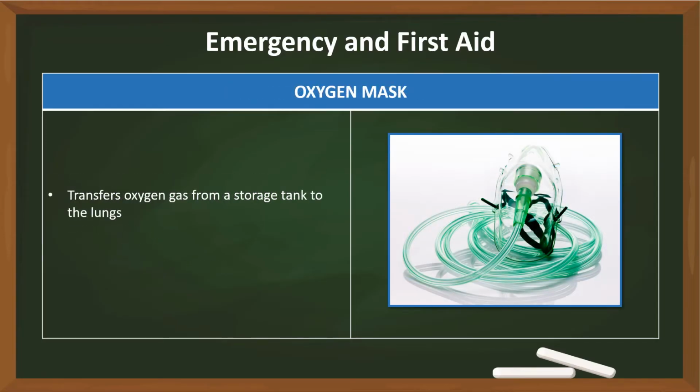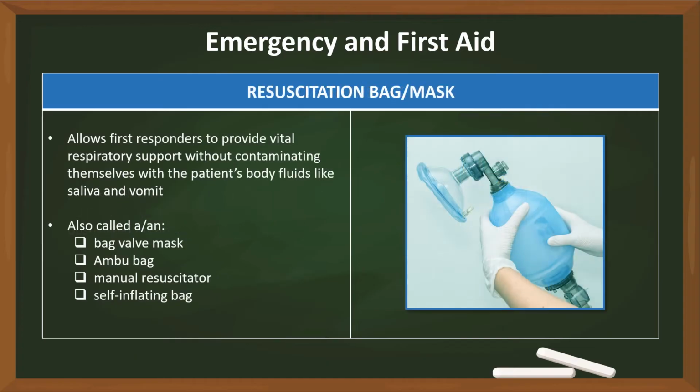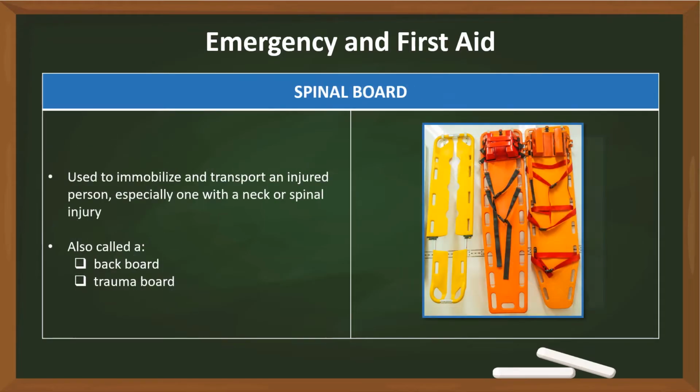Oxygen mask. Oxygen tank. Resuscitation bag or mask. Spinal board.